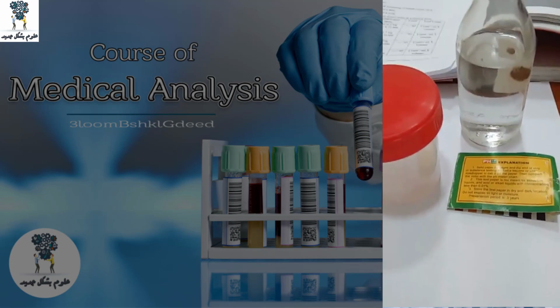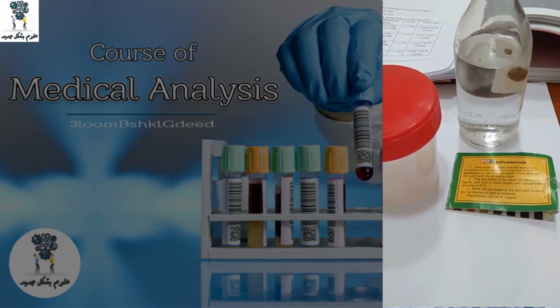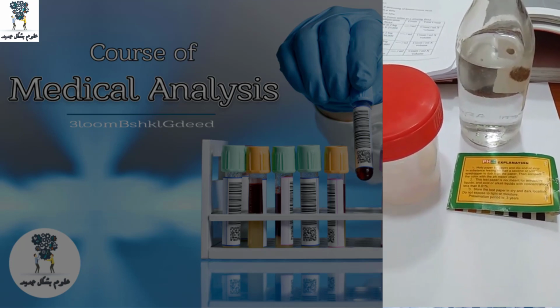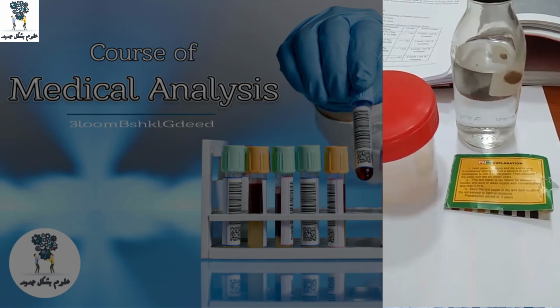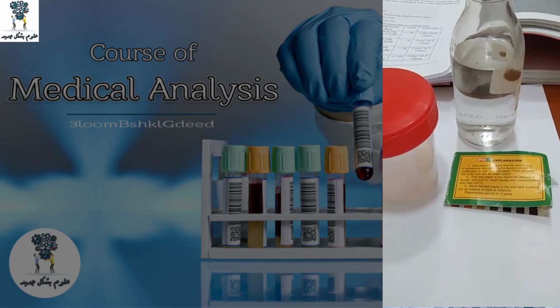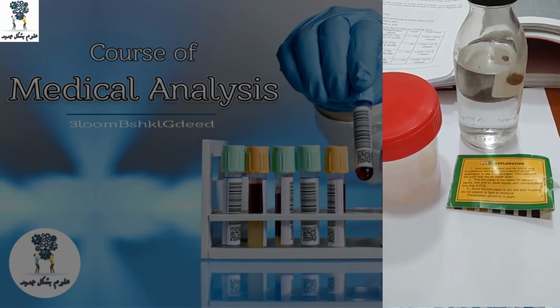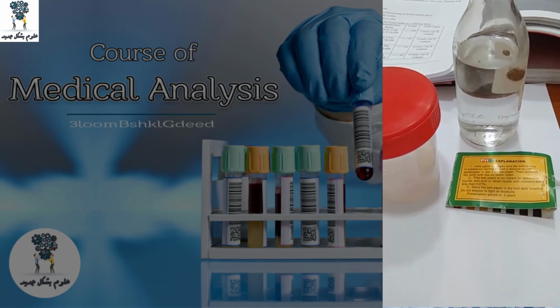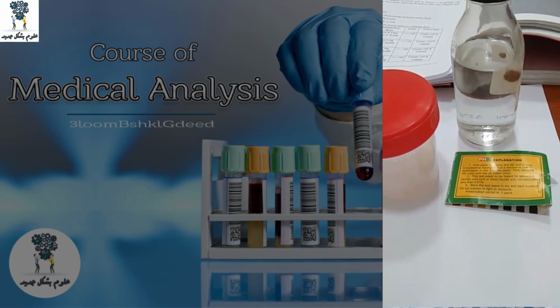If they are dead or immotile, they absorb the color of the dye. So when we look under the microscope, we will find pink color at the head. So they are dead sperms. If they are alive, but we had a suspicion from the first, we will find no dye in the sperm, no color.